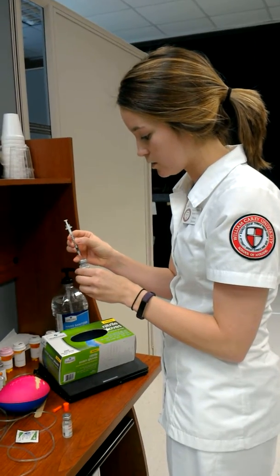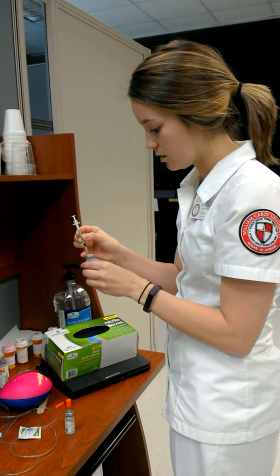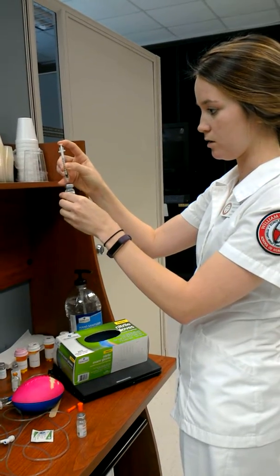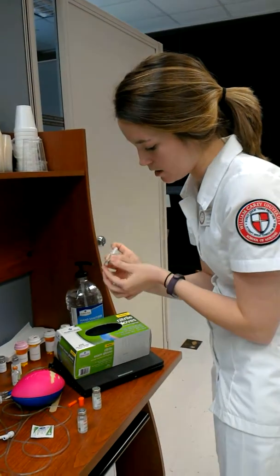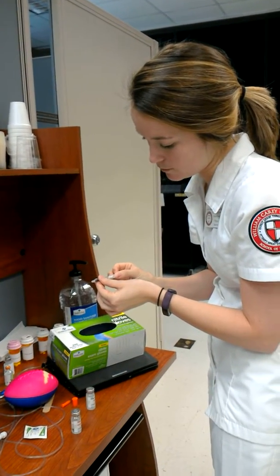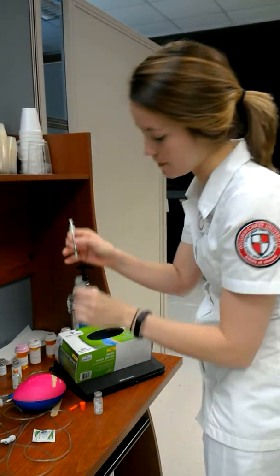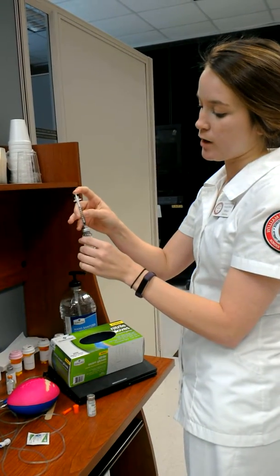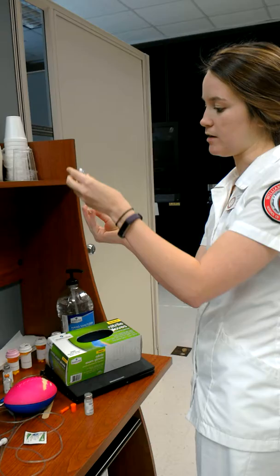So I will make sure to go in but not touch the solution. Insert my 5 units of air and then pull out. And then come back, since I'm doing 5 units of regular, put in 5 more units of air. Come here, inject to the regular, and then I'm going to go ahead and draw up my 5 units.